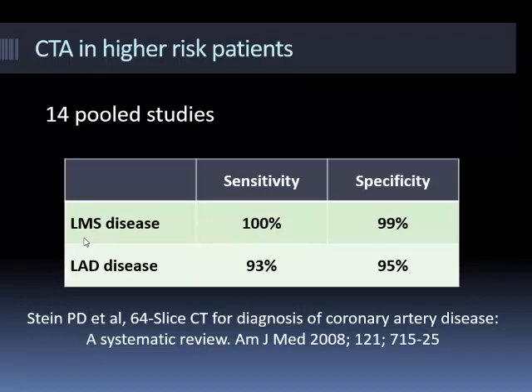There was a study announced this year for the FFR measurement by CT. The CT flow, I don't know if you are aware. I think Taryn's got a talk on that, because obviously you can apply FFR. They have announced some results similar to established lesions and find how significant they are by using a special software. Yeah. I mean, we've got a talk on that, so you'll hear all about that.